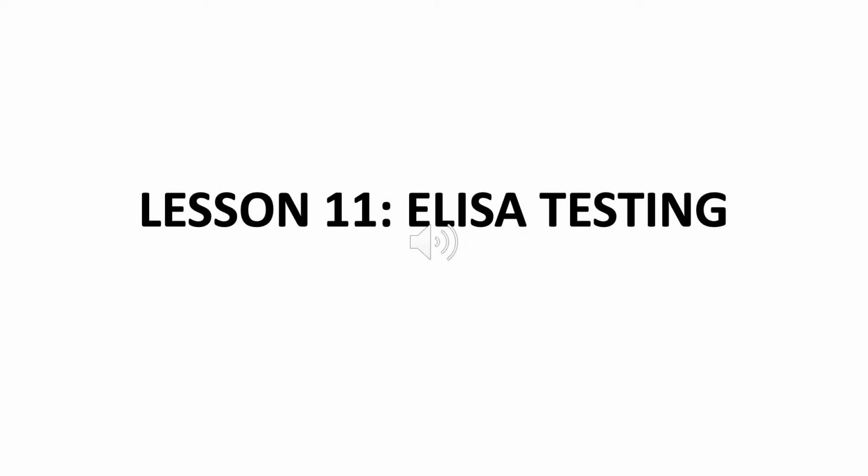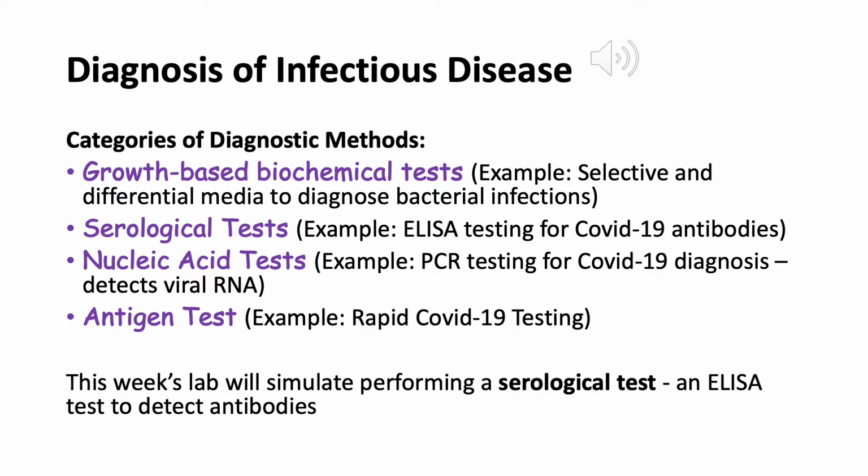Lesson 11 is about ELISA testing. This week's lab is about the diagnosis of infectious disease. So there's a few categories of the diagnostic methods.